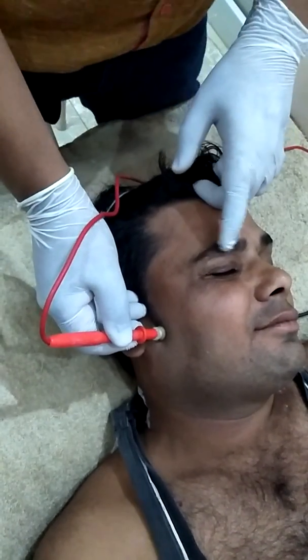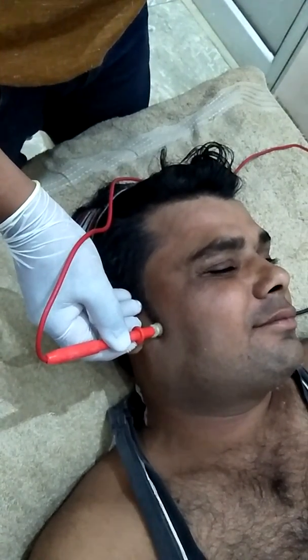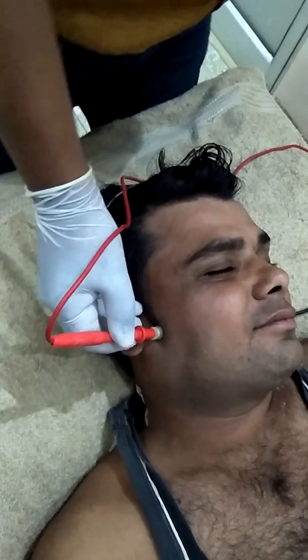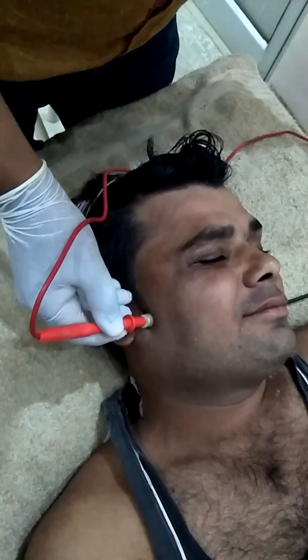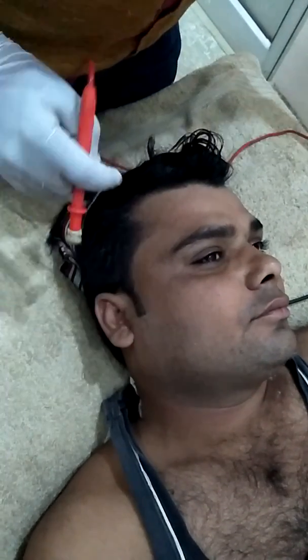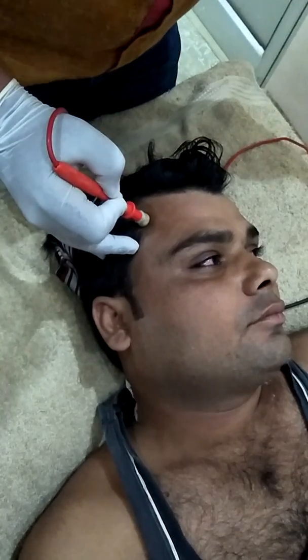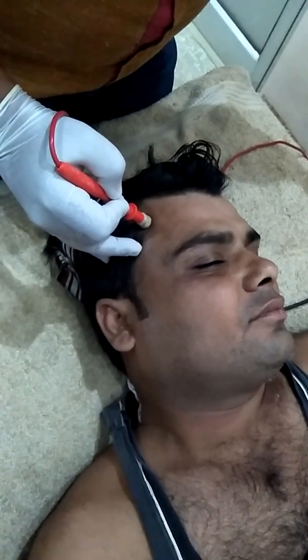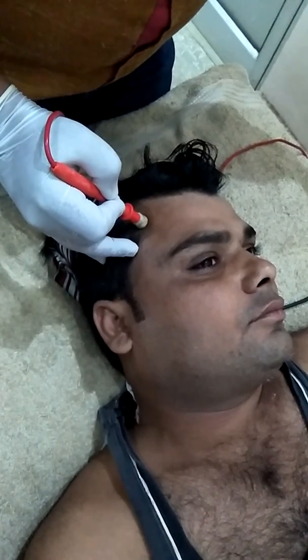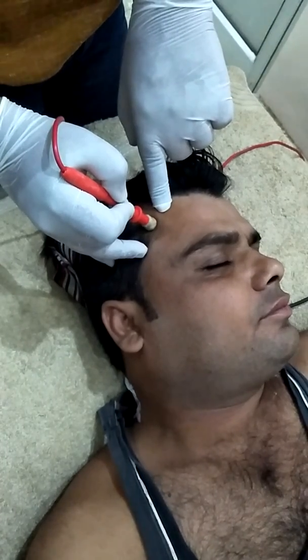You see the contraction in the eyes and lips both. This is the root of this nerve, and again we place it on the frontalis branch. You see the contraction here.